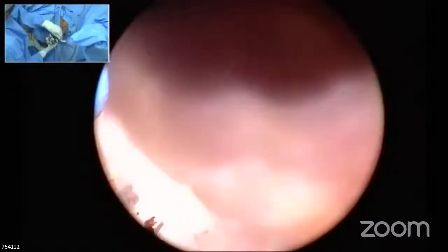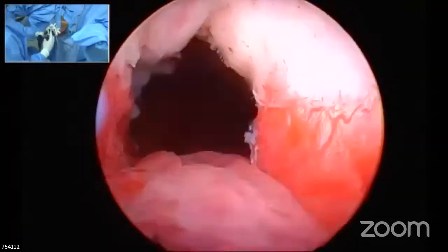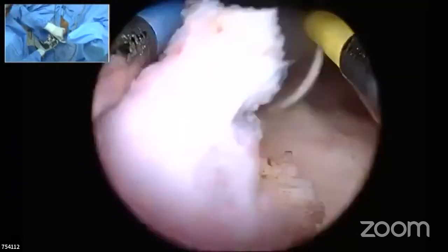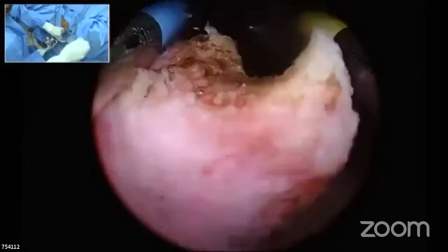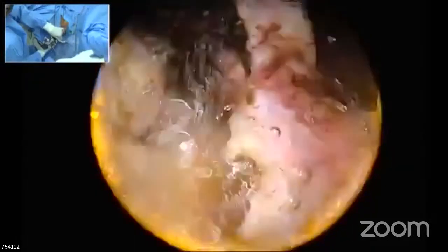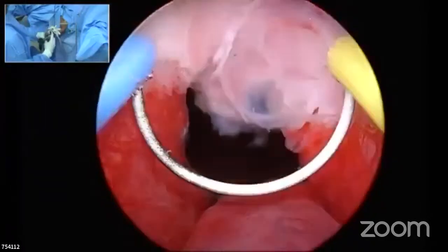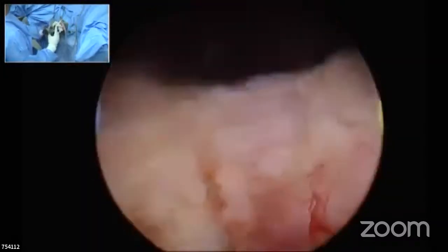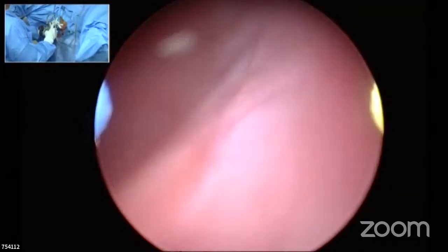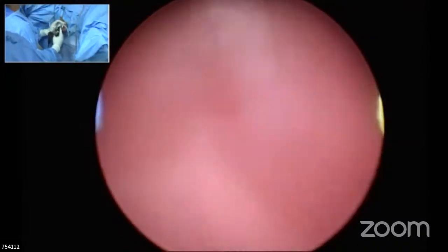There's a small flap of tissue which can be resected, which need not be resected also, that gets stuck there into the roof. I think I resected it. It's creating a big flap there. Yes, so I'll take care of that. This extra tissue need not be resected because the sphincter lies very close to that area, and in this area also, we don't resect it. I think I've completed the resection. I'll do the HoLEP and I think you can go ahead with the next case, sir.